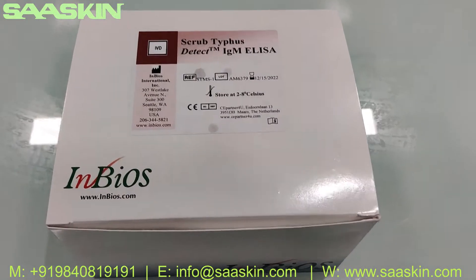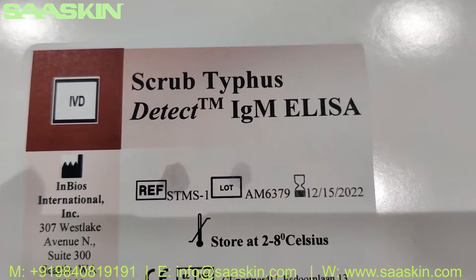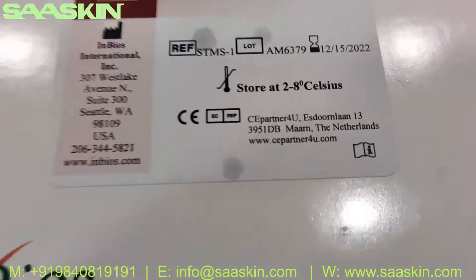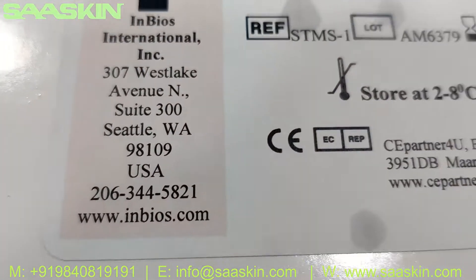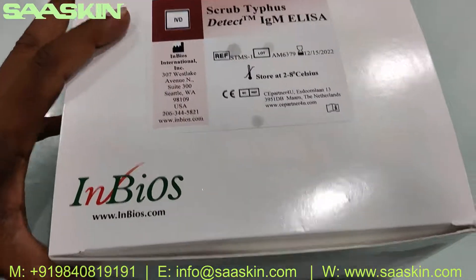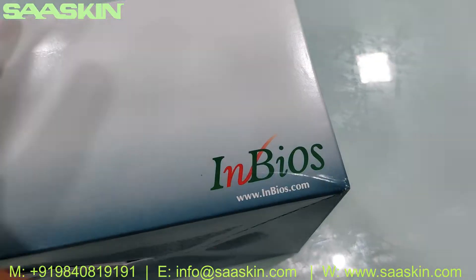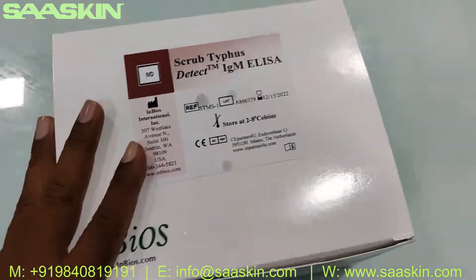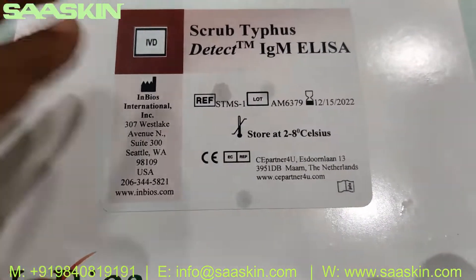Hello everybody, today we're going to see the INBIOS Scrub Typhus Detect IgM ELISA kit for detecting IgM antibodies. This is a completely CE/IVD certified product from INBIOS International. I'm going to show you the product — you can see different views of it on all sides. On the top you can find the name and part number.